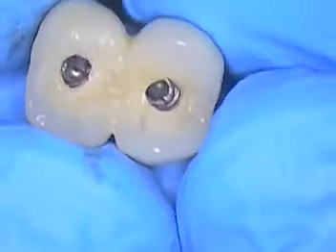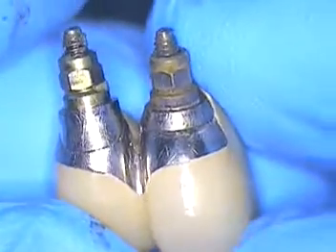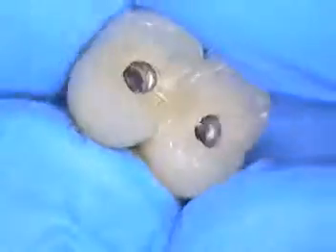We'll see if any of the screws can be retrieved or retightened, but we're going to have to clean everything up. All right, so we'll catch you on the next clip. Let me just take a look — Francis, I'm just going to take a look in your mouth.